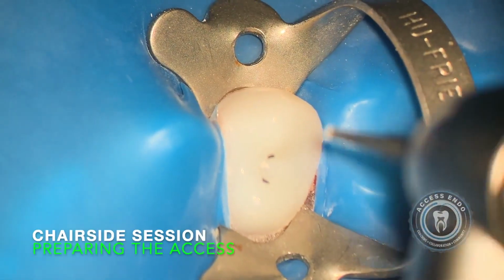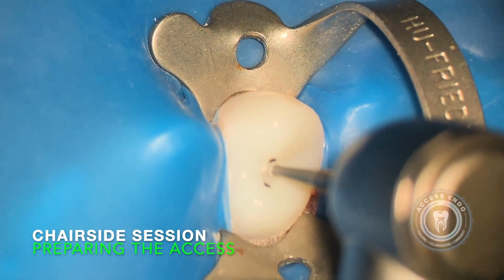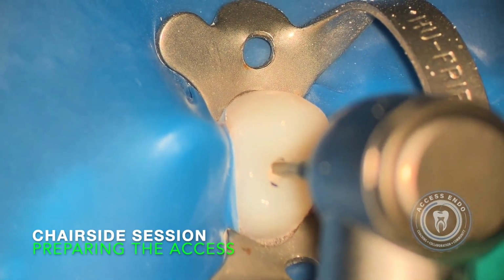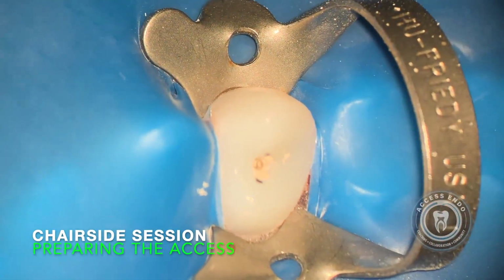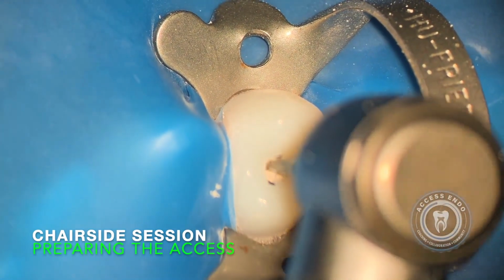As you're here chairside with me, I want to give you these little tips so you can carry them back to your chair. Now I'm going to make a little more progress, going a little further apical, making sure I'm on the right long axis. That means both from a palatal and facial dimension, and from a mesial and distal dimension. It means staying down the center lane. That is the key.